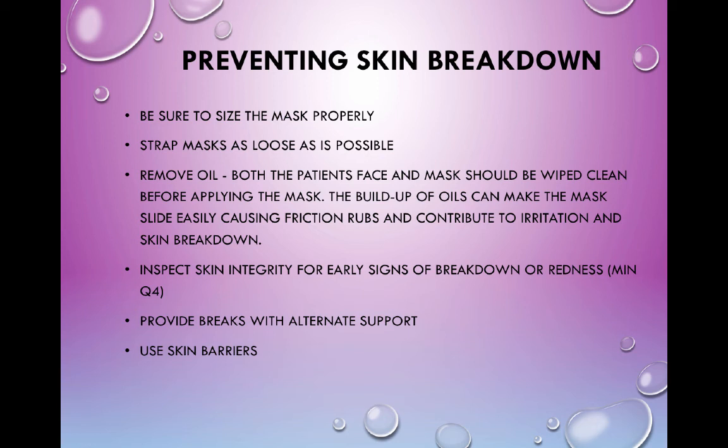Inspect the skin constantly. One of the things that we're really bad at is finding sores ahead of time and documenting it so that we can try to find a way to get around it. And then we also want to make sure we stick it on. There's some patients the doctors say, no, don't take them off. But we still need to assess their face, because if we start to get a sore, we've got to get on top of it. We can't wait and then after the sore's been there for 8 hours, realize that it's too open to do anything with it.